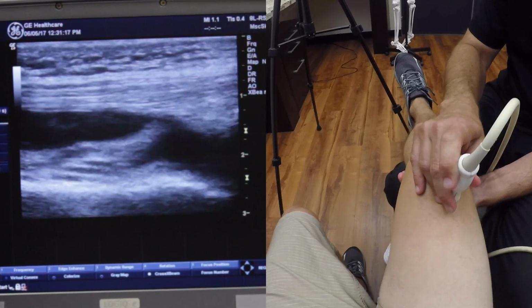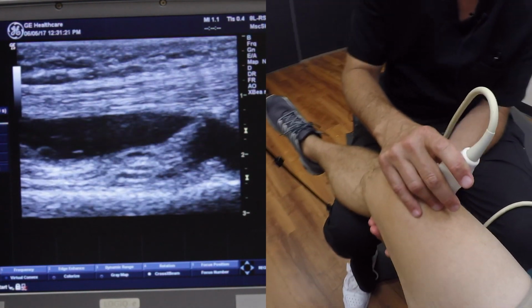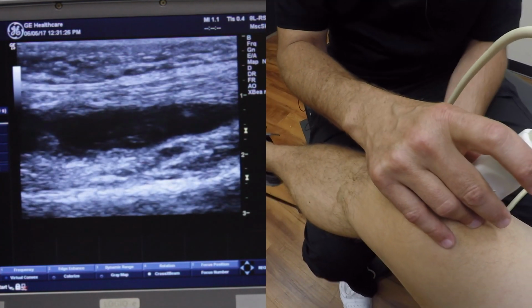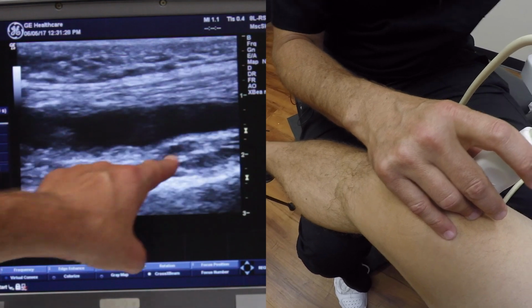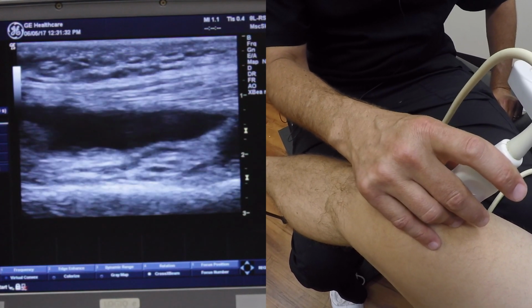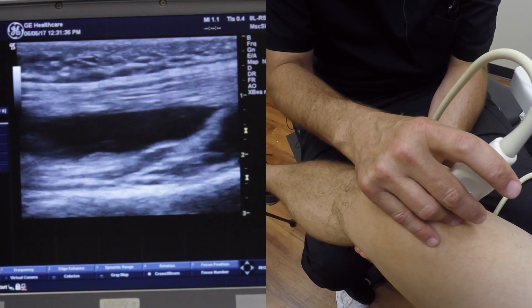So when we take a look in here today, right now on the spot, one thing I was quite surprised to find is that there is a considerable amount of joint effusion in this suprapatellar recess. So that's that black stuff. Yeah, this black stuff right in here is definitely increased effusion, probably about 10 cc's, an entire vial full of fluid that really doesn't need to be there.